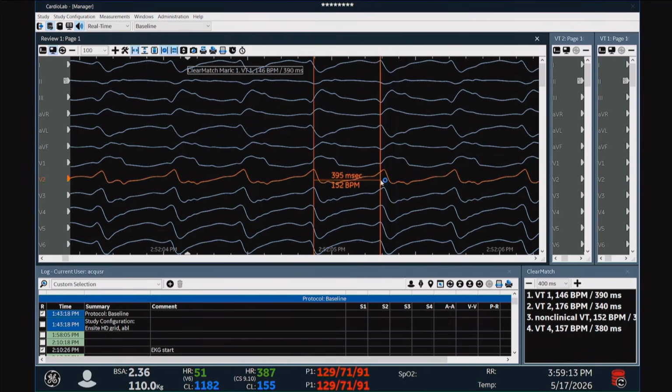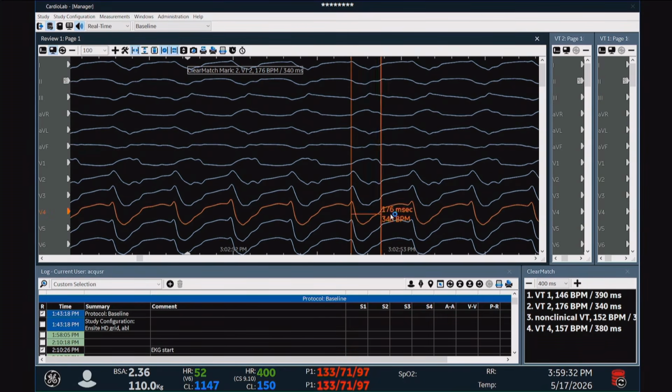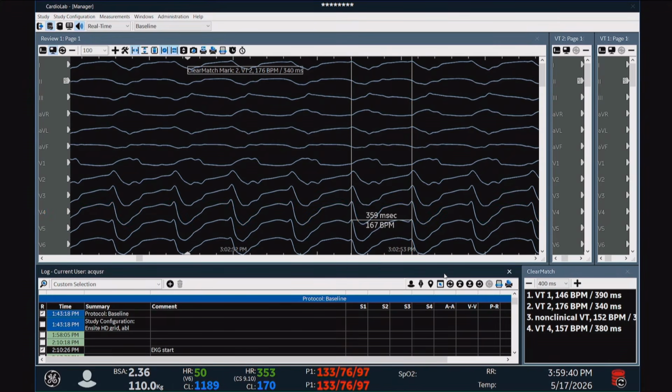Yeah. Just that this is VT1, which we then cardioverted. We had to cardiovert repeatedly, nearly 7 times, because it was very irritative. So VT1 is more lateral mid, can be higher on the lateral wall. Can we go to VT2? Which is more similar, but more apical and maybe more down on the inferior wall. We can also correlate that with the body surface mapping, but the ECG for now would be good enough.